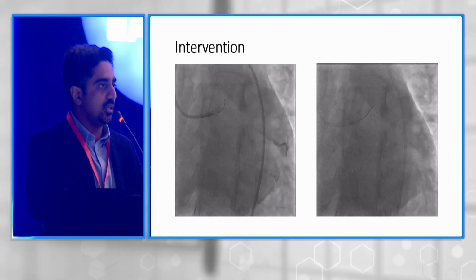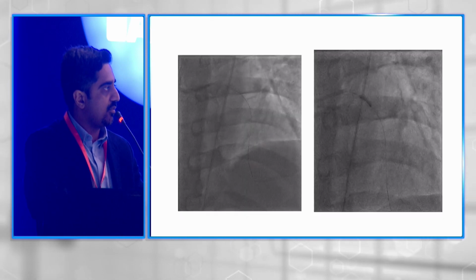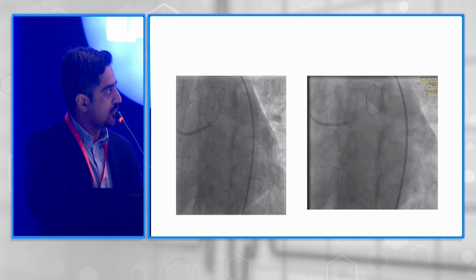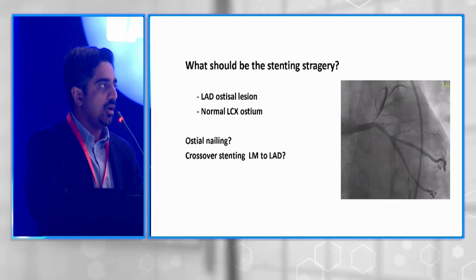But dual injection. So we tried to cross the lesion with a Pilot 100, crossed it with a 100 XT, and we were actually able to advance the wire down to the LAD. And after some pre-dilations, this was the result. So we were left with this situation.